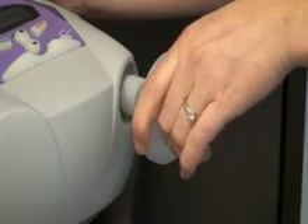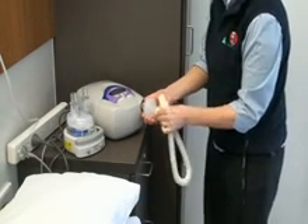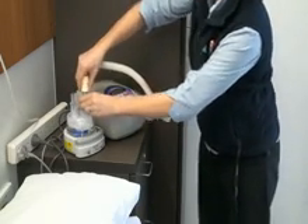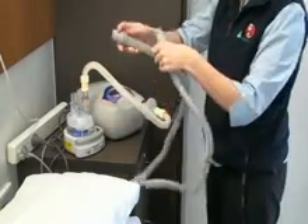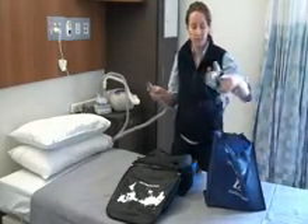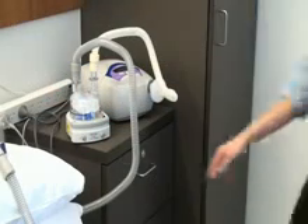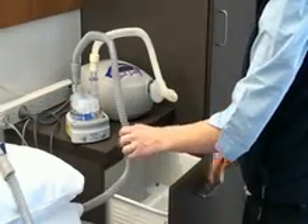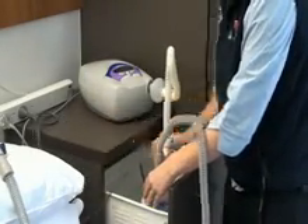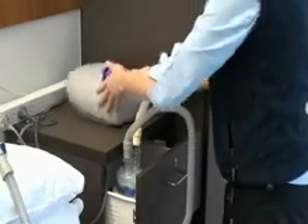Connect the SureGuard filter to the ventilator air outlet. Connect the short breathing tube from the filter to either of the ports on top of the humidifier chamber. Connect the long breathing tube to the other port, and connect the other end of the tube to the mask. Place the humidifier inside the drawer or on the shelf of the bedside table to prevent it from being knocked over. This completes the setup.